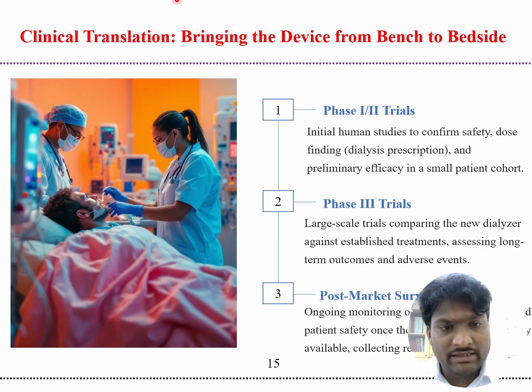And the clinical translation, like bringing the device from bench to bedside. Phase 1 and 2 trials initiate human testing to confirm safety, dose finding, like dialysis prescriptions, and preliminary efficacy in a small patient cohort.